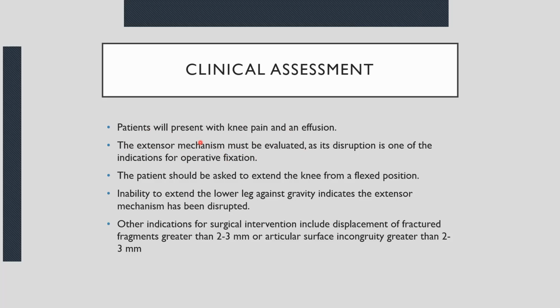Now, in most cases, it's a difficult thing to do in the acute setting of an emergency department because the patient is in a lot of pain. They're holding their leg in a fixed position. They're guarding it. So it's really one of those things that you've got to note if it isn't there, but you can't say, all right, listen, because it isn't there, this patient definitely needs a procedure or needs fixation or needs to go into theater. But it's one of those things that if you note that it is completely absent, you have to put it there.